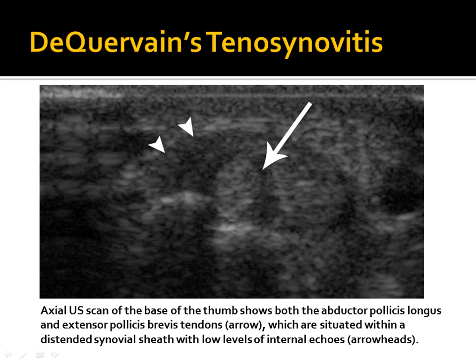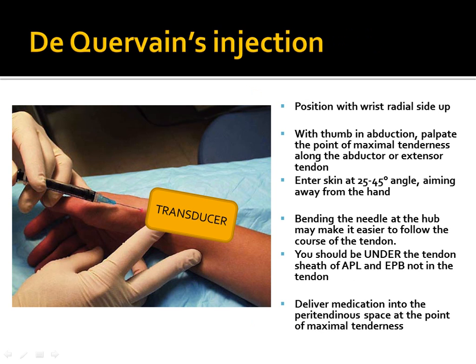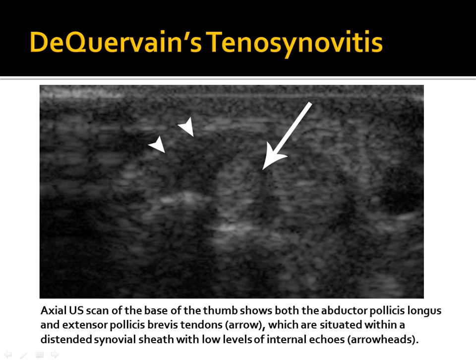De Quervain's tenosynovitis involves inflammation of the abductor pollicis longus and extensor pollicis brevis tendons, surrounded by a distended synovial sheath. It's a painful inflammatory condition of the thumb and wrist that can be successfully treated with ultrasound-guided corticosteroid injection. Position the patient with the radial side up, transducer along the wrist radial side. This is a peritendinous injection — you look for the extensor pollicis brevis and abductor pollicis longus tendons, but do not inject into the tendons or tendon sheath; stay outside.